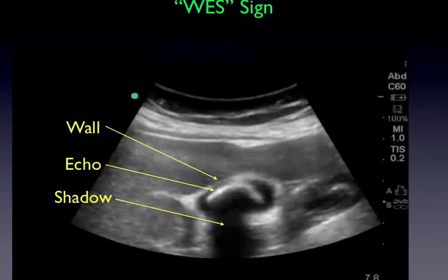Now this is an unusual clip that I've just showed you in terms of clarity. Normally, the WES sign is not this apparent.